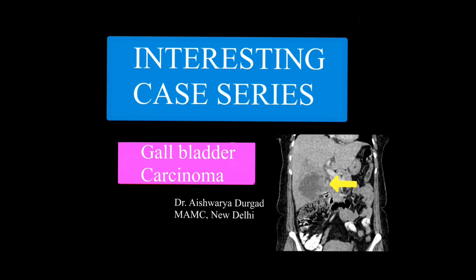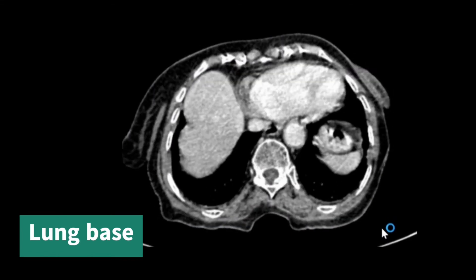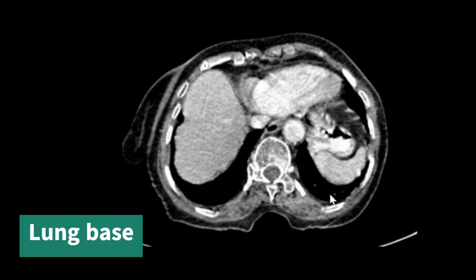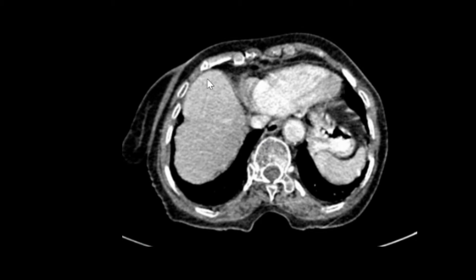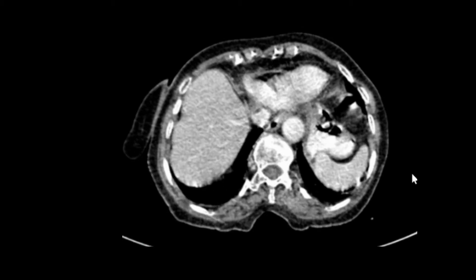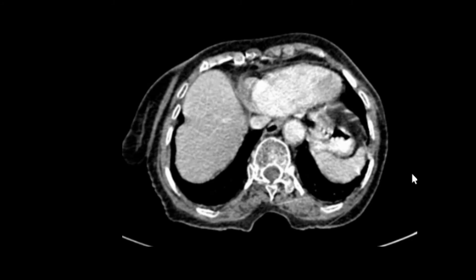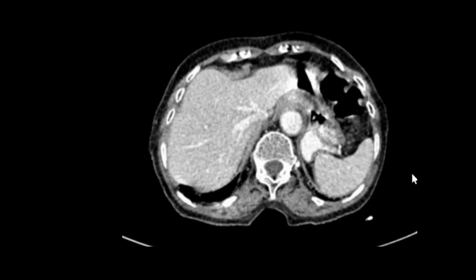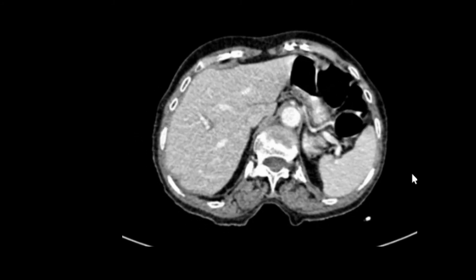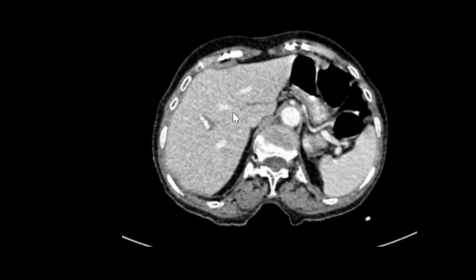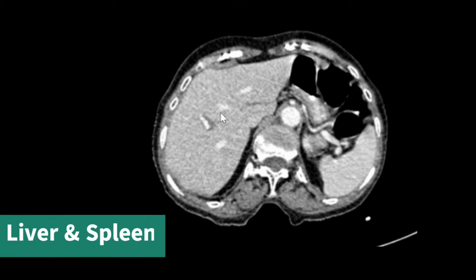Let's see contrast enhanced CT axial sections. Coming from up to down, we see the lung bases. We start to see the liver and the spleen, then as we move down into the abdominal sections. Now here we can see the liver in entirety and portal veins are enhanced, so this is a portal venous phase.